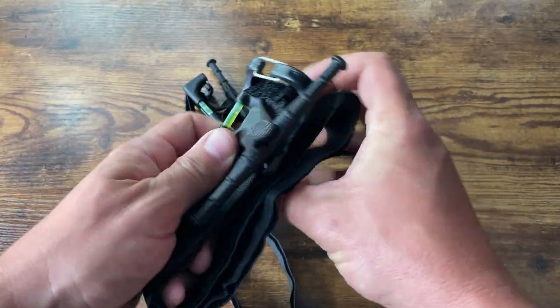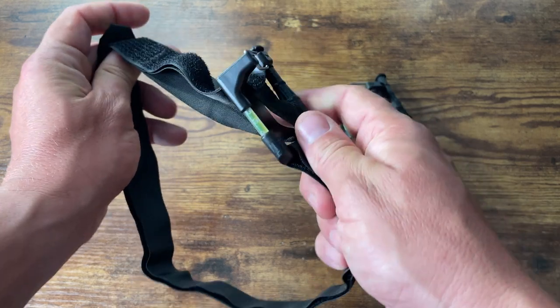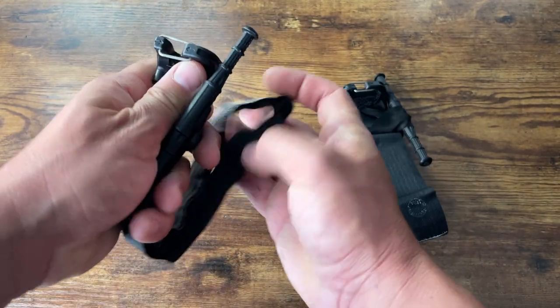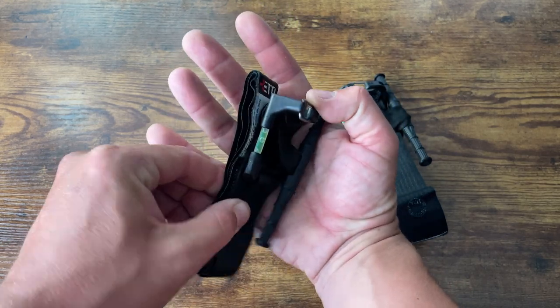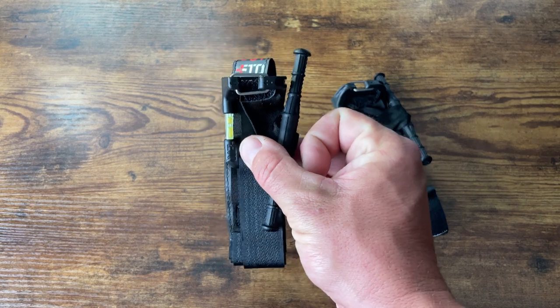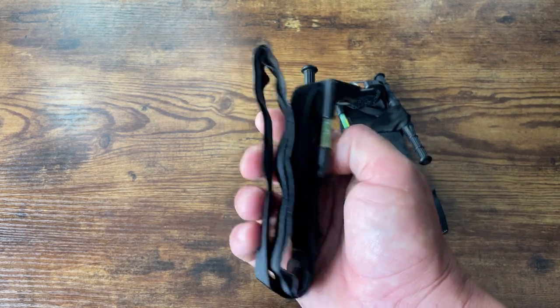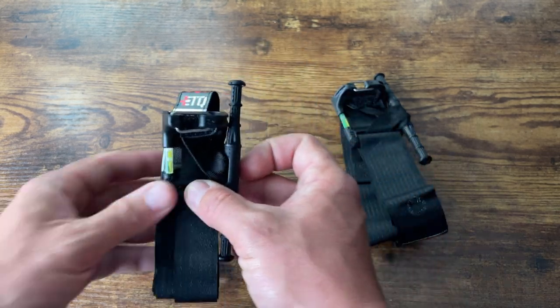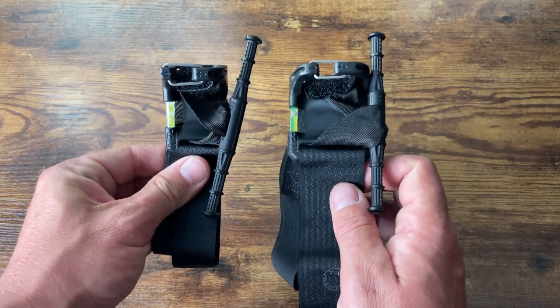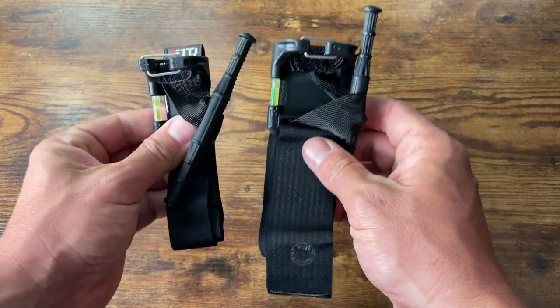This is the bigger Snake Staff tourniquet. The smaller one is questionable because the strap is so thin - it's meant to fit in a pistol mag pouch and it easily does. You can see how small it is. It uses the same chem light and windlass retention system, but the strap is really really small. You can probably use it on an adult arm, a kid's arm, or a dog, but putting this on a thick thigh - it's probably not going to cut the mustard. I have more faith in the bigger one. There are tests out there already on the Snake Staff - go check them out, I really like these.